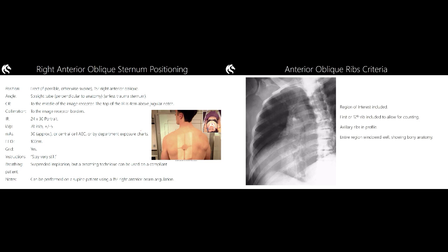Maybe one, maybe two. If you've got a compliant patient, you get the patient to walk in to the side of the X-ray table. And lean. Sorry about that, deafening up the back, gentlemen. And once they have leaned right over that X-ray table, you can then perform two obliques, an RAO and an LAO, very, very simply by just changing your tube angulation, displacing your bucky tray. Okay? I would like for you in your upcoming lab next week to try a leaning over sternum, okay?